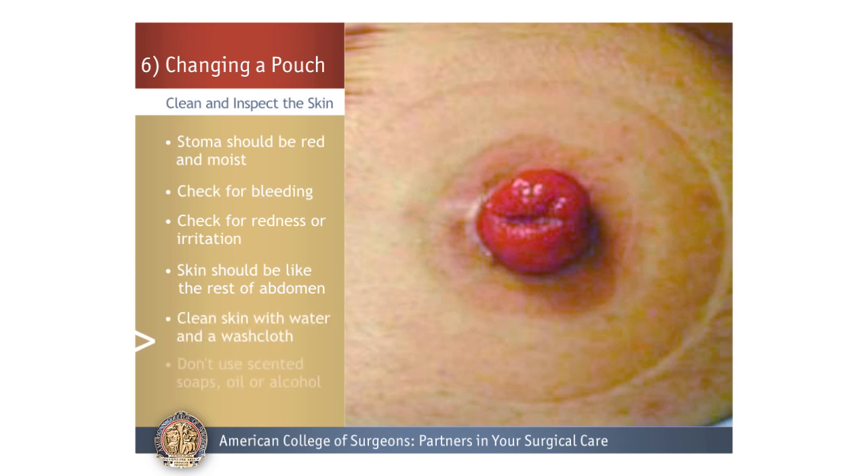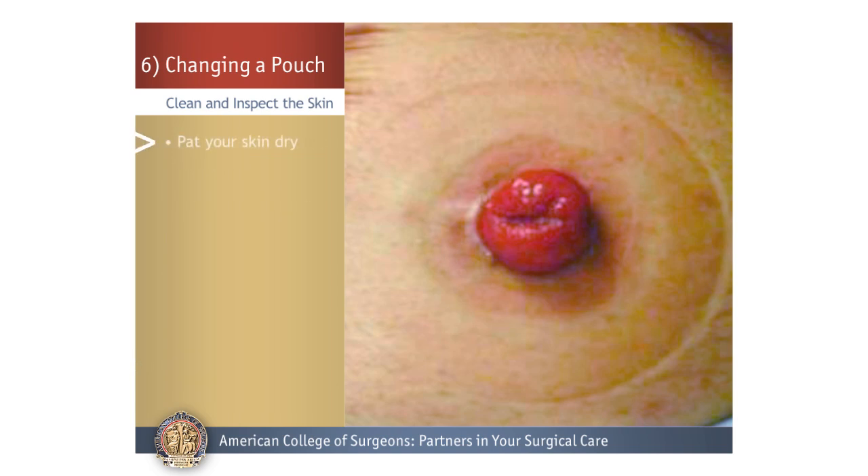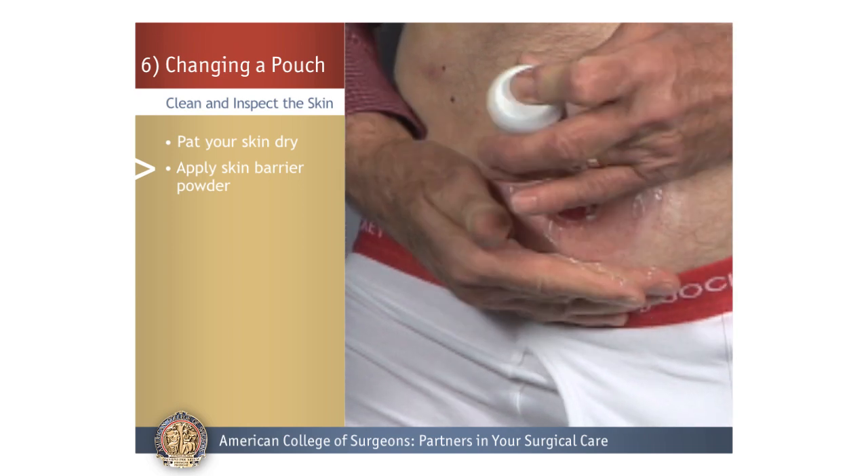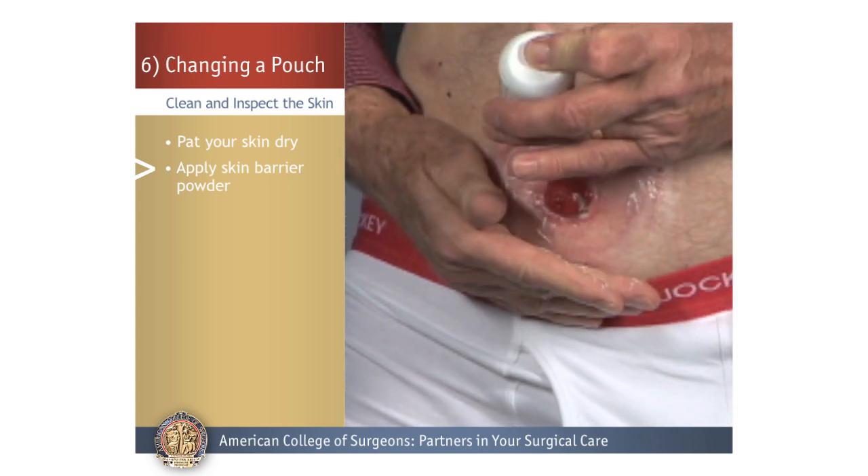After inspecting your skin, clean it with water and a washcloth. Do not use scented soaps, oil, or alcohol. Then gently pat your skin dry. If the skin around the stoma is irritated or weepy, you can apply some skin barrier powder to absorb the moisture. Remember that your new barrier will not stick well if your skin is moist.